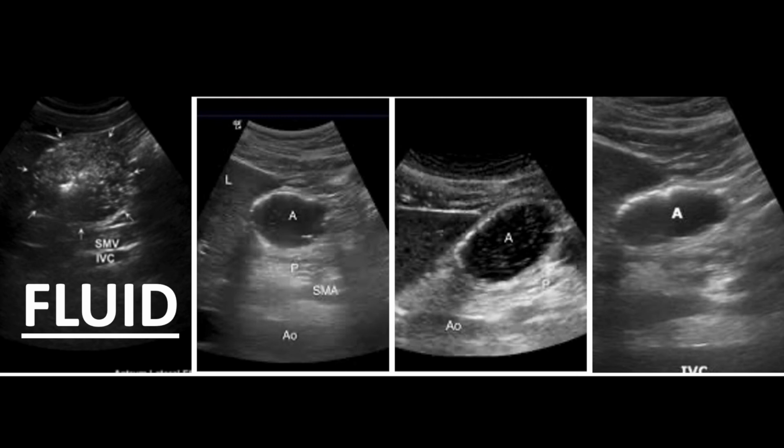The antrum will be rounded and distended. Walls will be thin due to the increased volume within the stomach. Fluid provides an enhanced view of deeper vascular structures. If fluid was recently consumed, a starry night image can be appreciated. The antrum will be anechoic with white air bubbles.